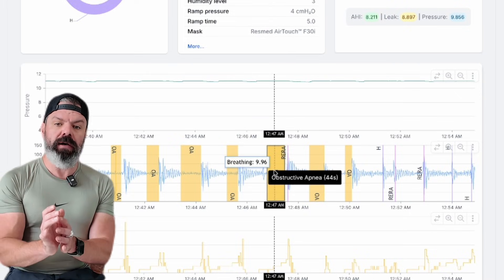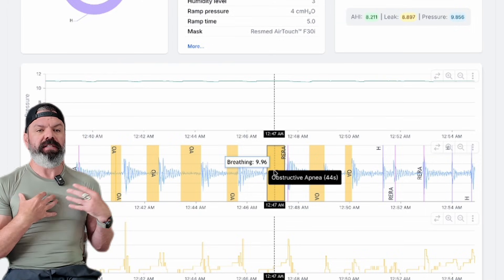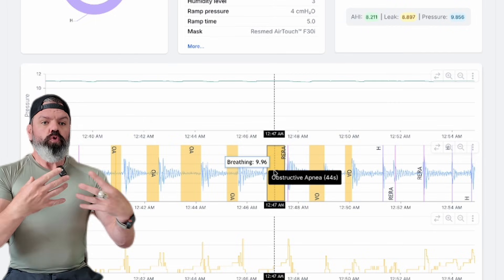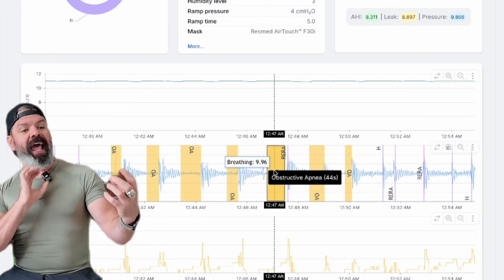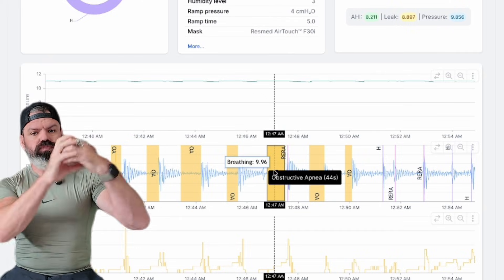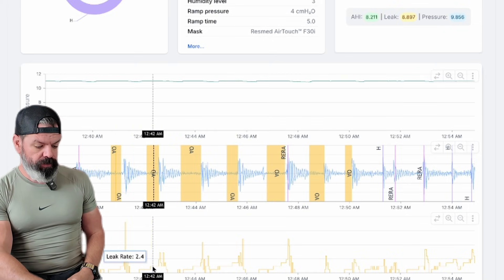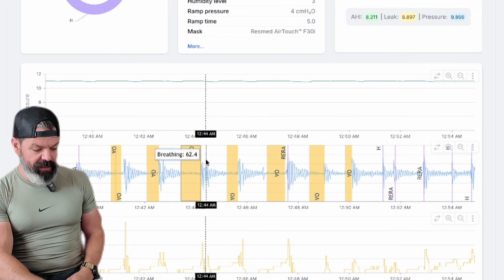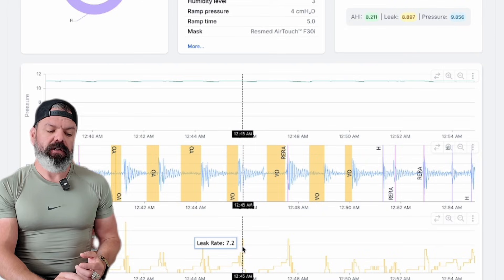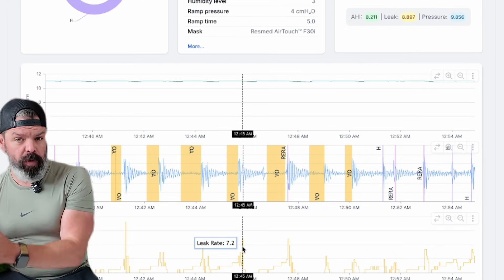Because of this apnea, he's hyperventilating — he stops breathing and then starts taking these great big deep breaths. As he breathes out, with the airflow coming in, it's causing the leak. You can see it here — boom, boom. Every time he hyperventilates, you get the increase in leak. So his apnea is causing the leak; it's not the mask's fault.